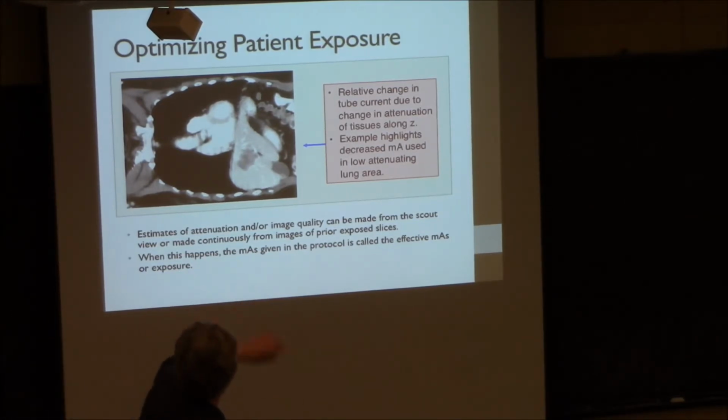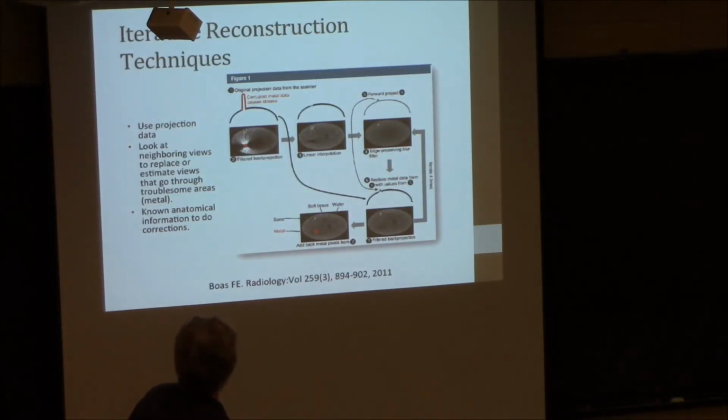I used to have a diagram of how much dose. Basically, around the neck, you get a small amount because it's not very big. Then you get into the chest, it went way down. And then when you get in the abdomen, it starts going up again because you have more tissue there. And then you run into the bones of the pelvis, and that's a problem.